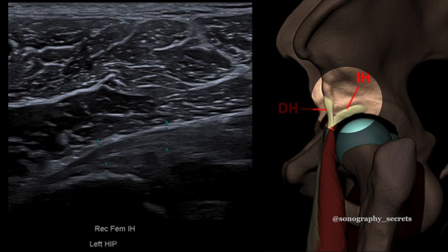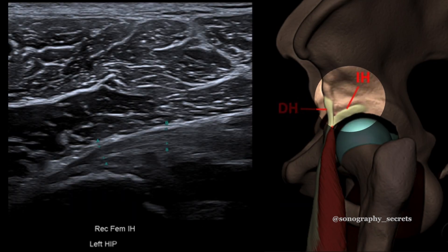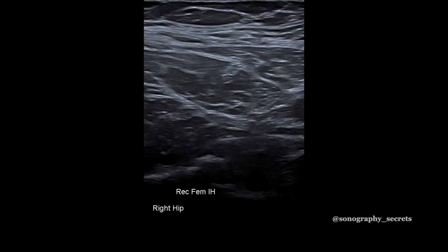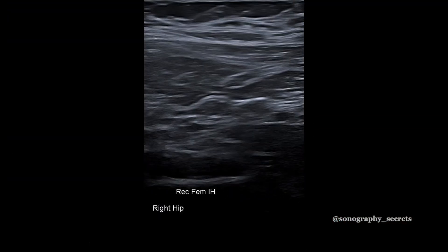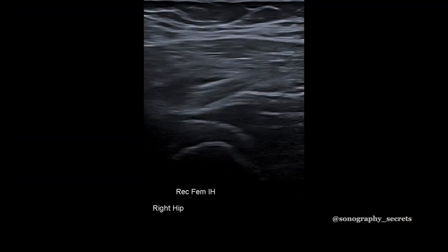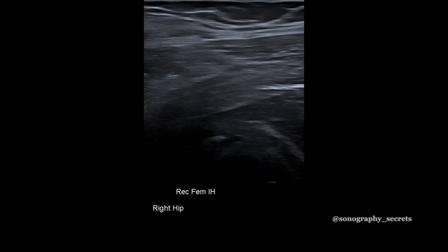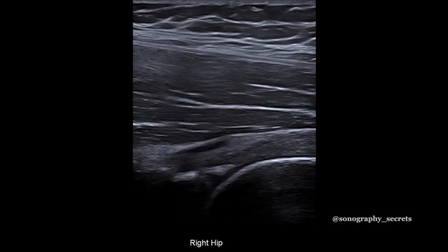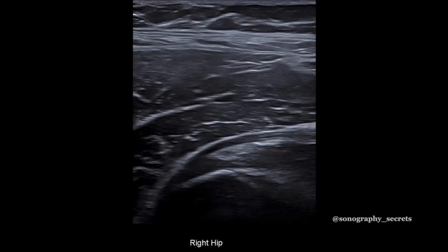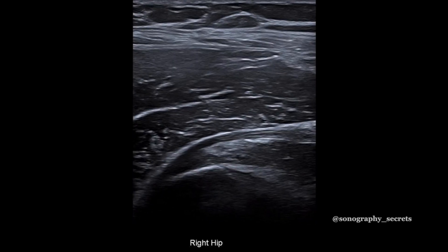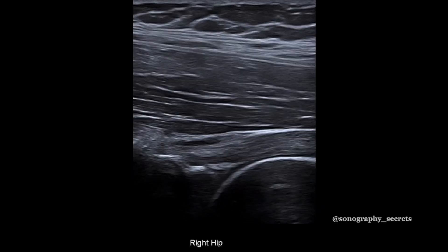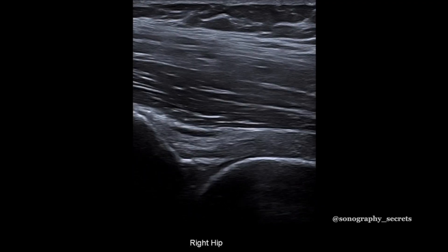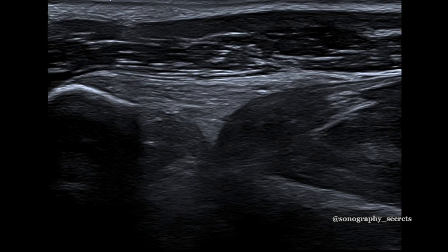The origin of the indirect head looks like this, and the easiest way to identify this is to simply find the central intramuscular tendon more distally, turn long on it, and follow it back to its origin at the lateral aspect of the hip joint. It's also possible to identify this from a lateral approach with the patient lying on their side. It's important to be able to identify this origin especially in the case of an acute injury. The two tendons do form a conjoined tendon of sorts, though there is only a small intermingling of fibers.